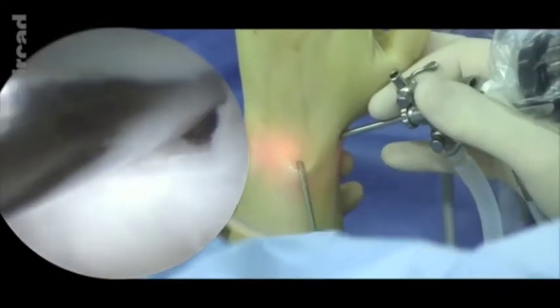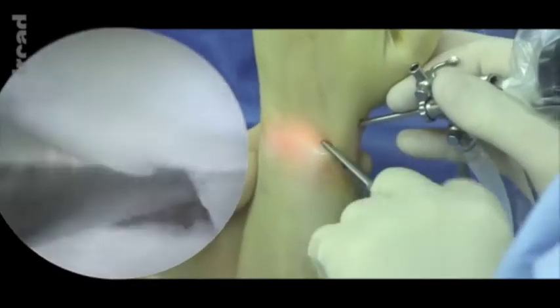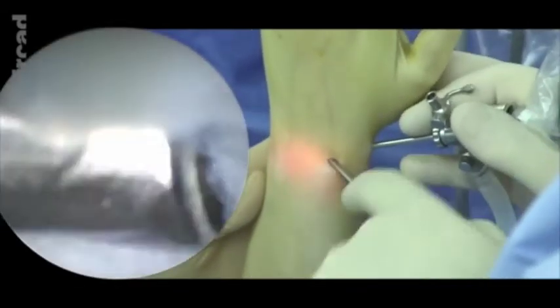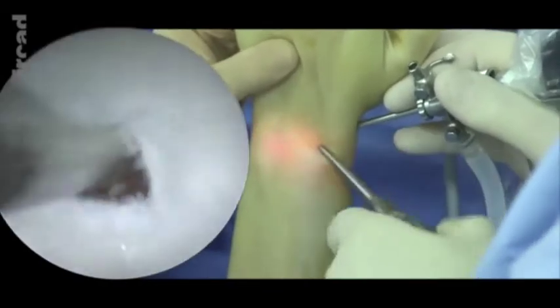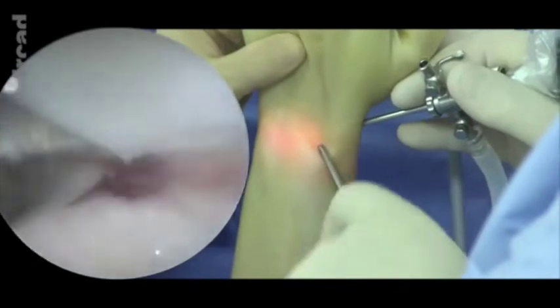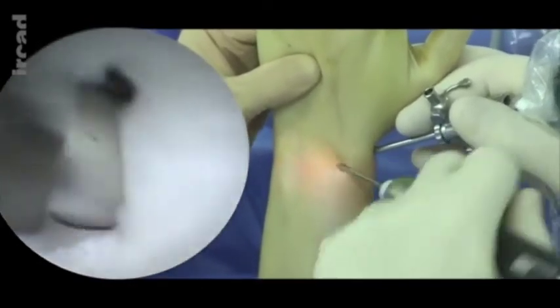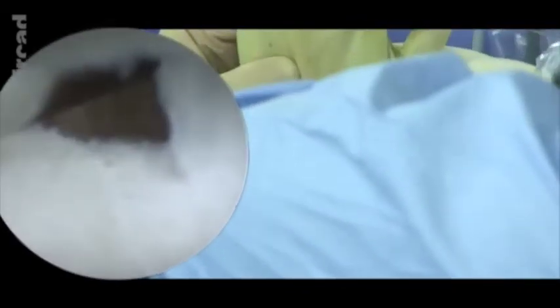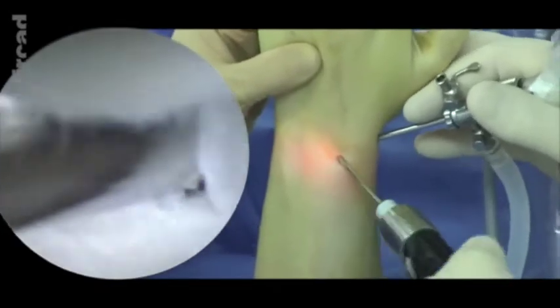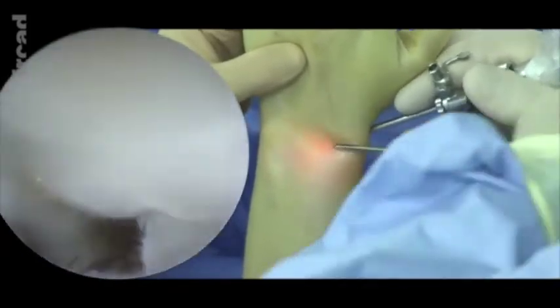A small curette is also used since the wall must be properly cleansed so that the graft can be effective. The technique may be painstaking and lengthy, and it is essential to proceed progressively. I use water, and the use of water will be discontinued when the grafts will be placed. Cleansing of the inside part of the bone ganglion is performed meticulously with the shaver. It is essential to perfectly clean the wall with rotating movements of the shaver and using the curette. The inside of the bone ganglion is perfectly visible here.